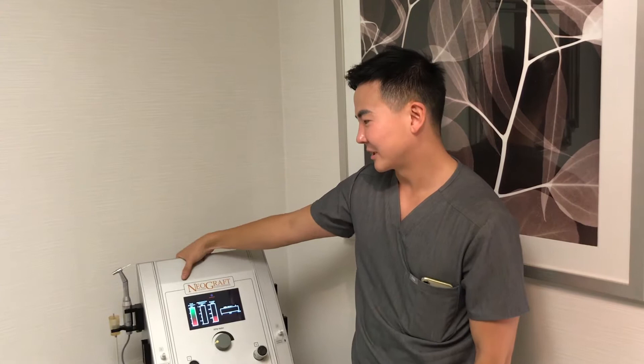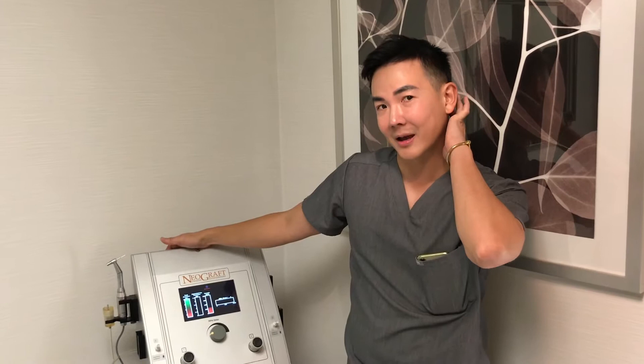We're going to use a NeoGraft machine, which is a semi-automated machine that helps remove individual hairs out of the back of the head. The old traditional way of hair transplant was to cut a very large piece of skin out of the back, which would then have to be sutured closed. The newer technique actually takes out each individual hair to transplant into the new area.